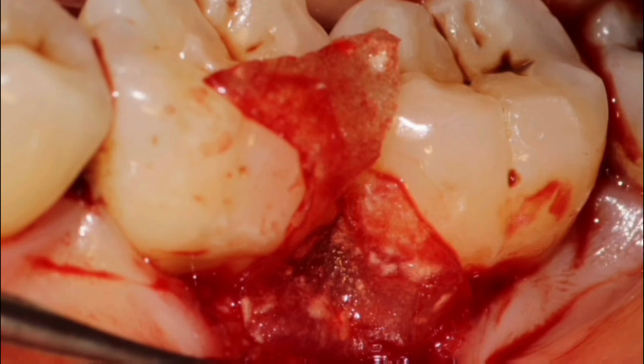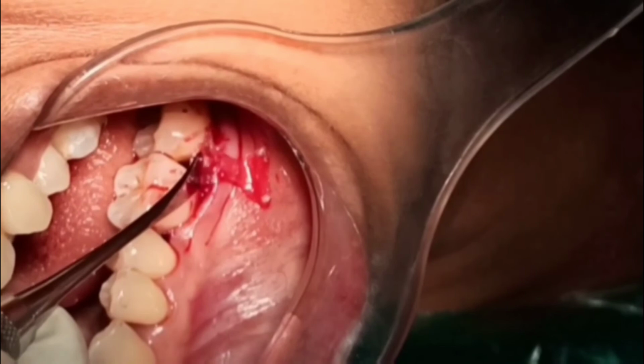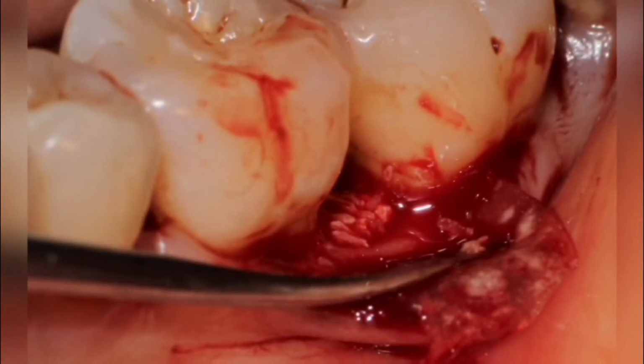A Periochol barrier membrane was cut into an appropriate shape and placed over the bone. Next, the osteograft bone graft material was used to fill the intrabony defect, and the membrane was approximated over it prior to suturing.